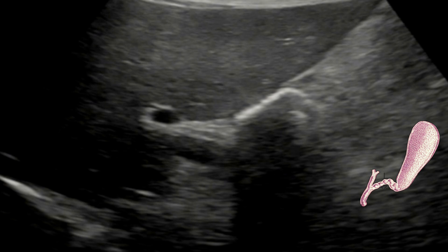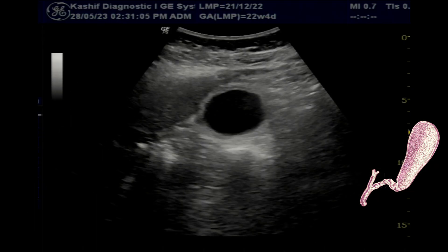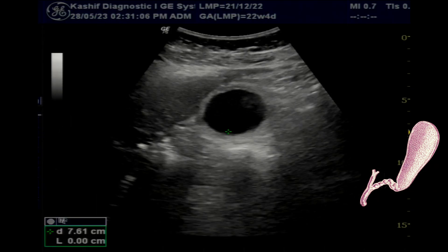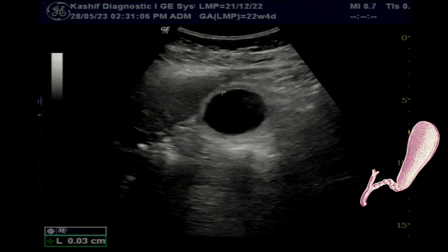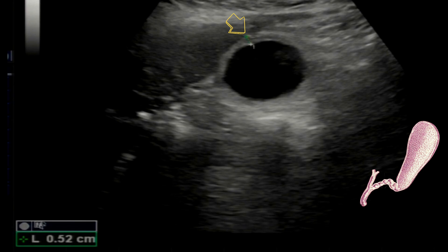The first ultrasound finding is a grossly distended gallbladder. The gallbladder wall is thickened — we can see this is 5 mm. No pericholecystic fluid is seen.